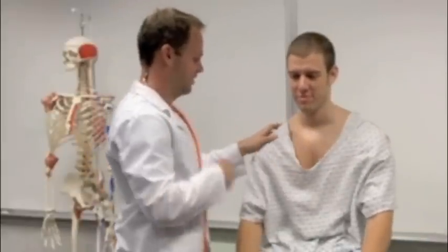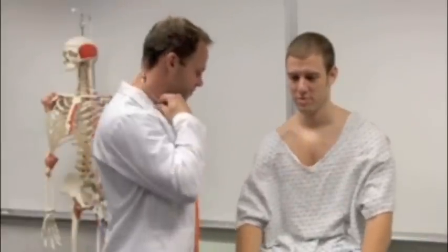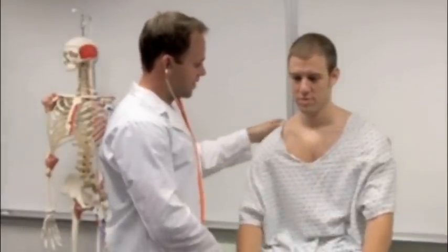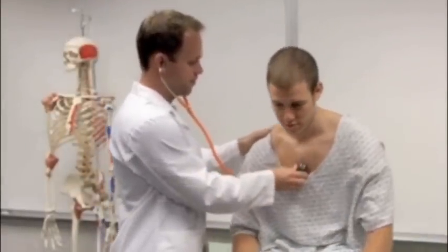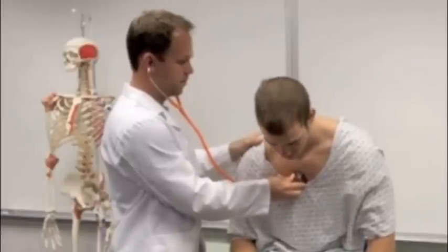To better assess the pulmonic valve, have the patient lean forward, making the sound more audible.